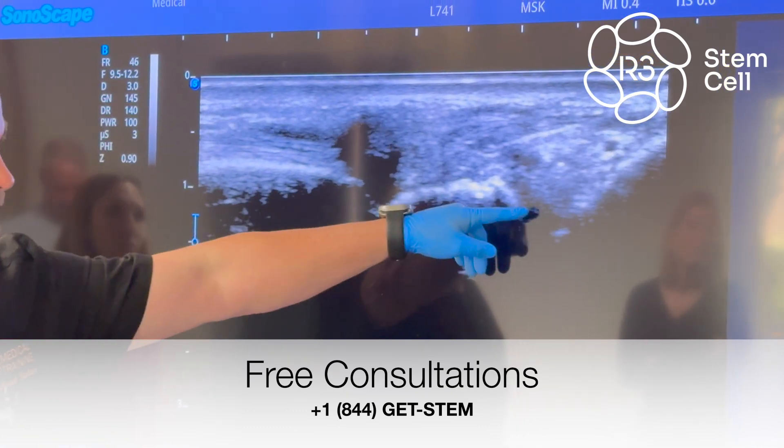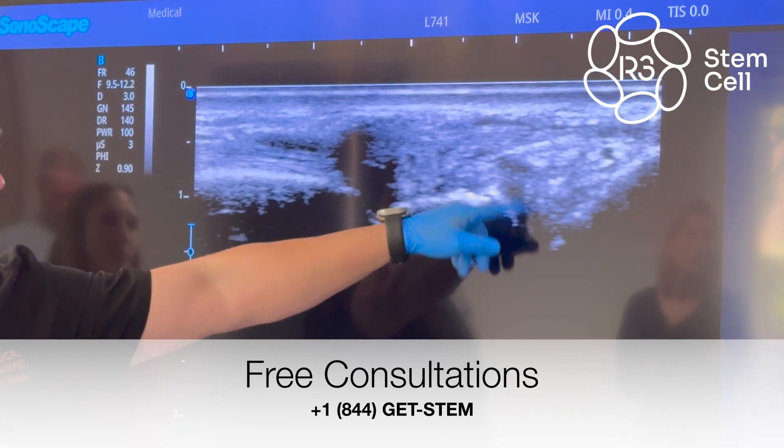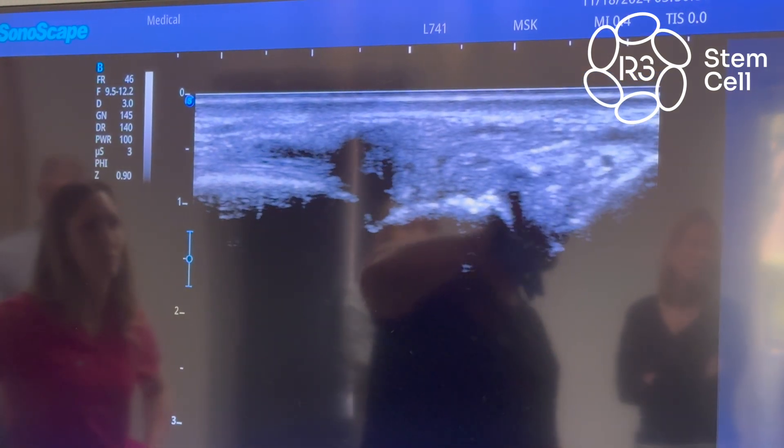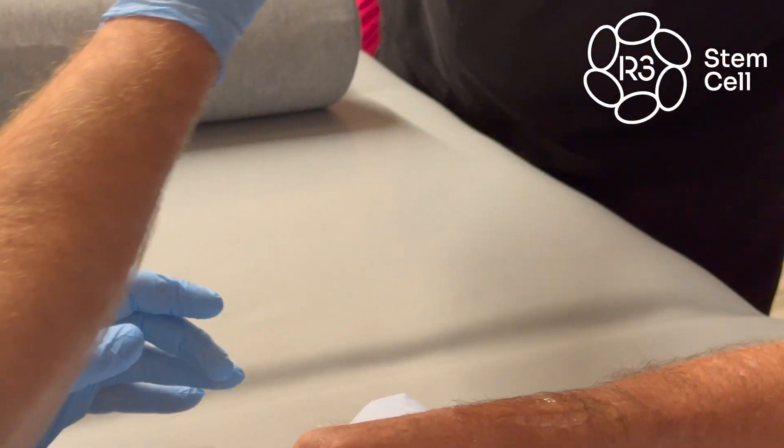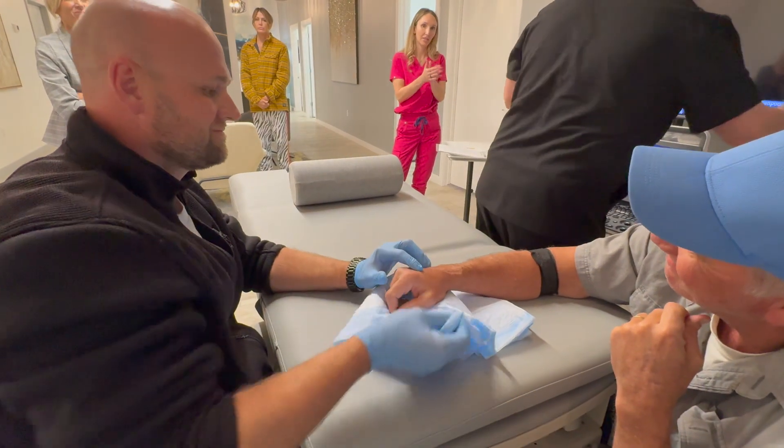See it flooding in there? We got a little across but we got a much bigger flood in there as well. There we go — we're all out. Well done — nice job! Everybody give them a clap.